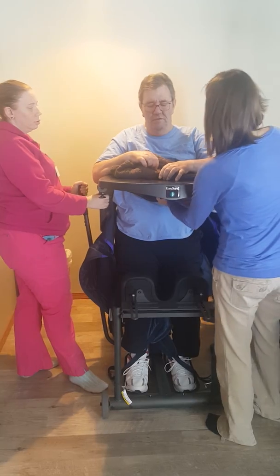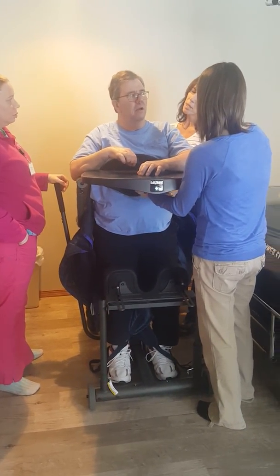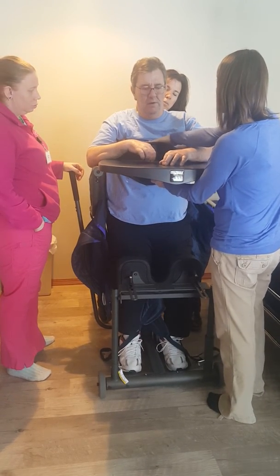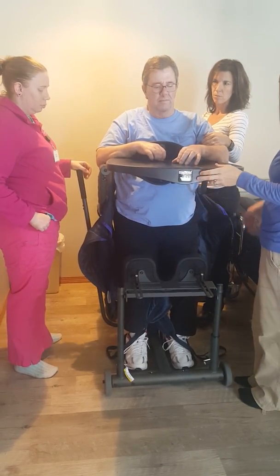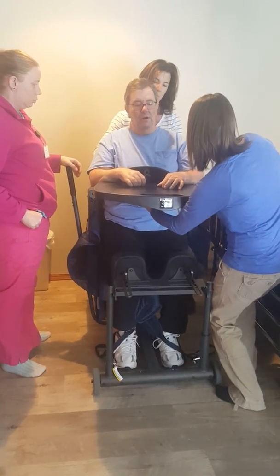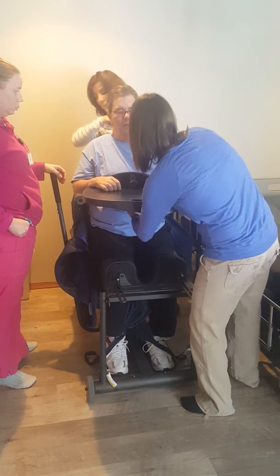Now we want to get this stuff out of here. Does it do any benefit sitting like this, Lori? No — I still got weight on my feet though. Because this is kind of a comfortable spot here. Is that far enough up? I think we're going down. And then we could go all the way down. Are we getting the pump enough? Not so far. Again, we've got to come up with that slope. I think that thing is way over here — you're tightening it. I think it's all the way forward as well.